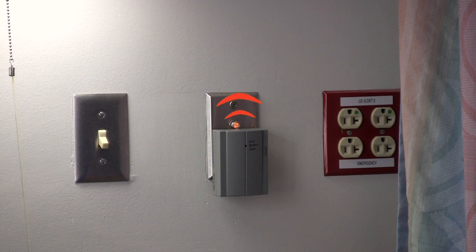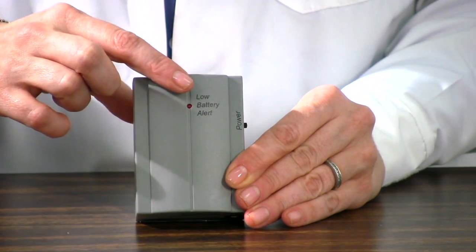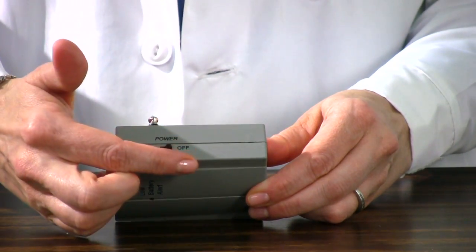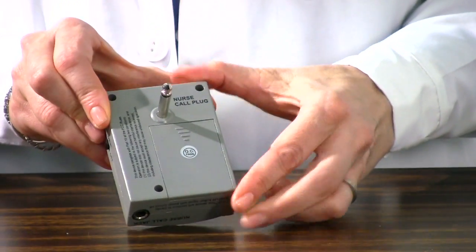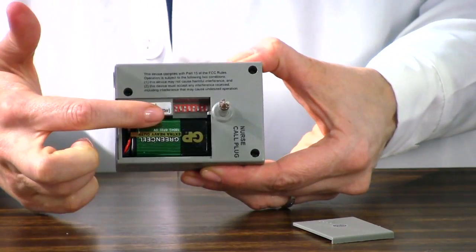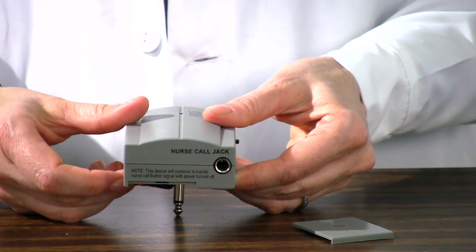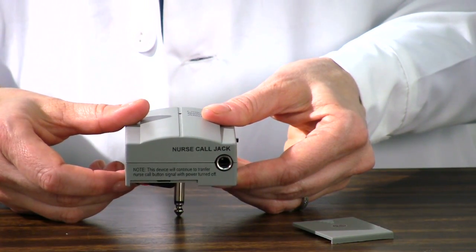The nurse call receiver unit works in conjunction with the alarm unit to signal the nurse call system without the use of cords. On the front is the low battery alert light. To the side is the power on-off selector. On the back is the nurse call plug and the battery compartment. Within the battery compartment is the transmit channel DIP switch, to be matched with the alarm unit. On the bottom is the nurse call jack for optional use with the patient's nurse call button.